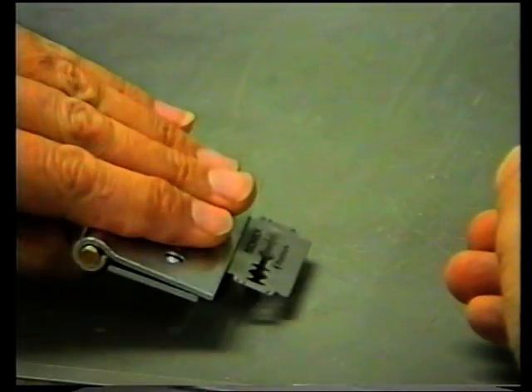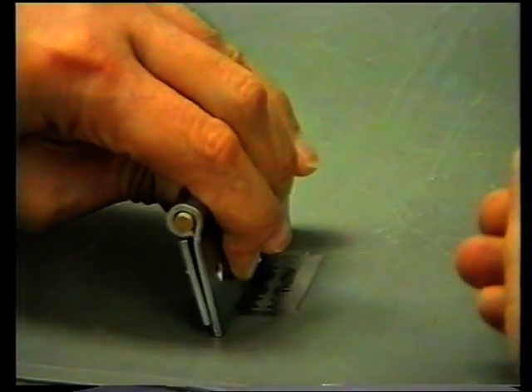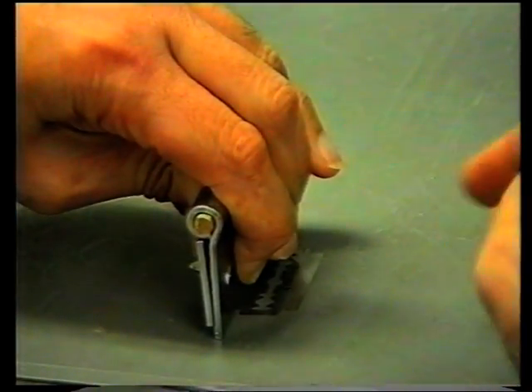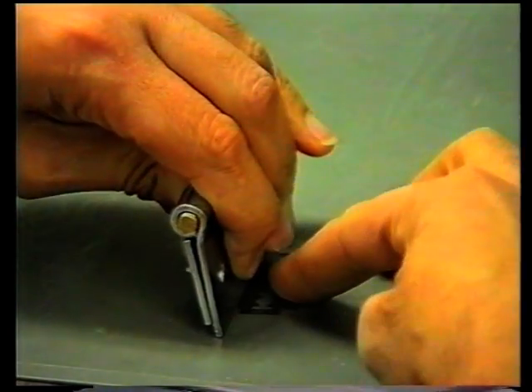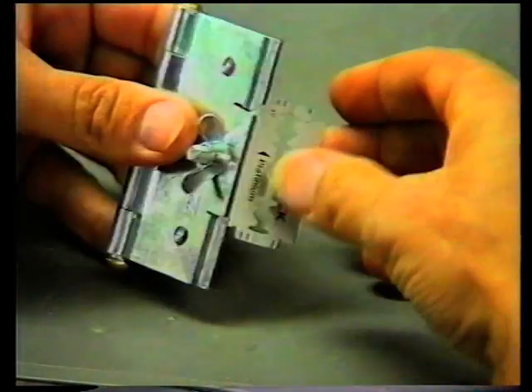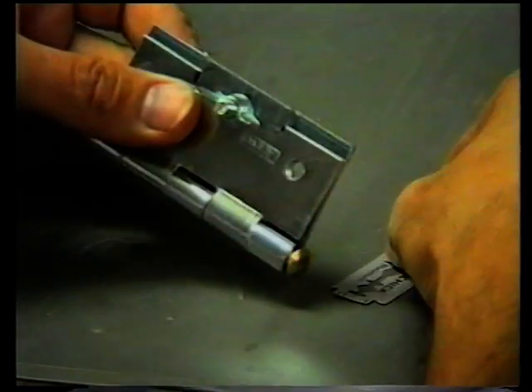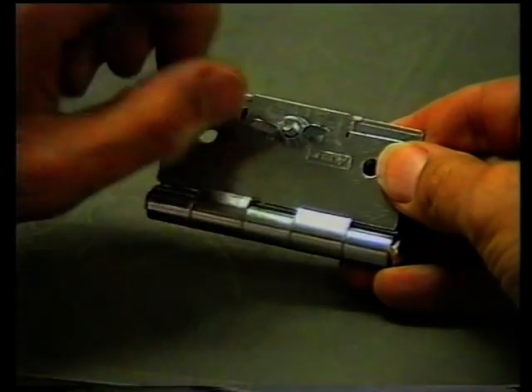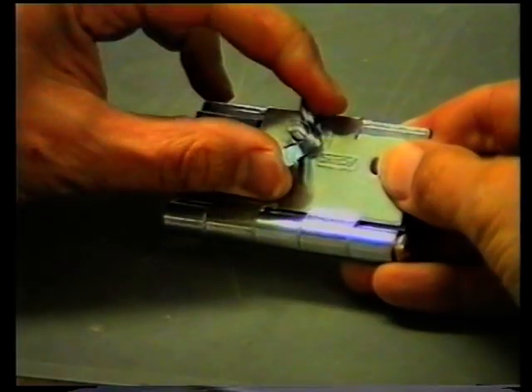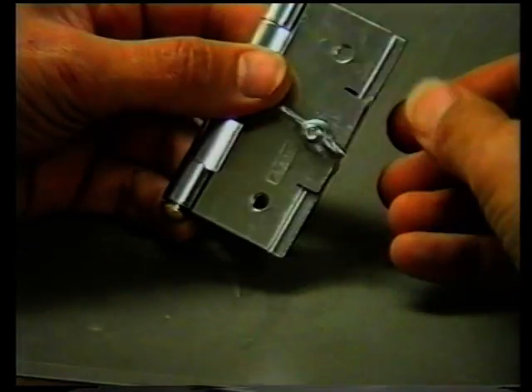Hold it flat against the surface with strong power and vertically, so as to hear a snapping moment whereby the blade actually will break. Be very careful because you may cut yourself badly if you are not careful to avoid this. We now have a straight blade which can serve for many purposes — the 1.6 blade.